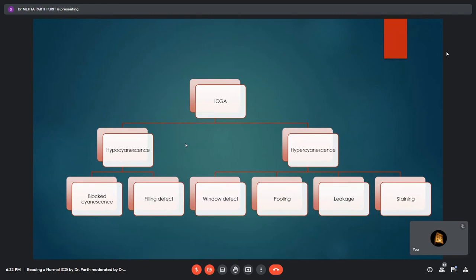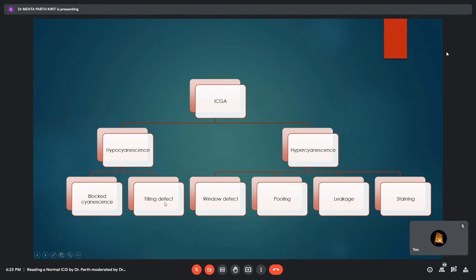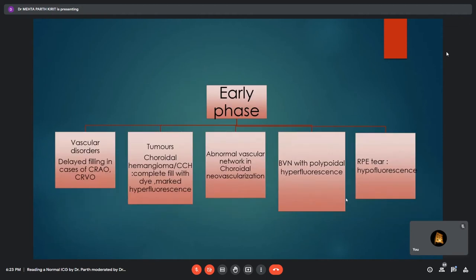Regarding interpretation of ICGA scans: in fundus fluorescein angiography the term 'fluorescence' is used, whereas in ICGA the term 'cyanescence' is used, though these terms are used interchangeably. Just as in FFA, hypofluorescence can be due to blocked fluorescence from blood or pigments, or due to a filling defect from loss of choroidal vascular tissue or infarct. Hyperfluorescence can be due to window defect from RPE loss, pooling, leakage, or staining. ICG is a dynamic scan requiring complete interpretation of all phases to reach a diagnosis, though certain conditions show characteristic features in specific phases.